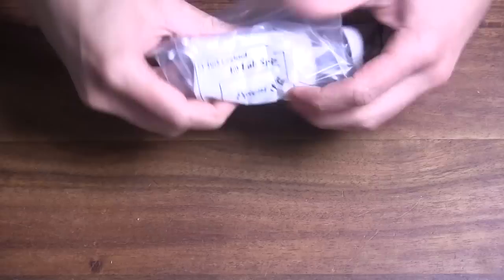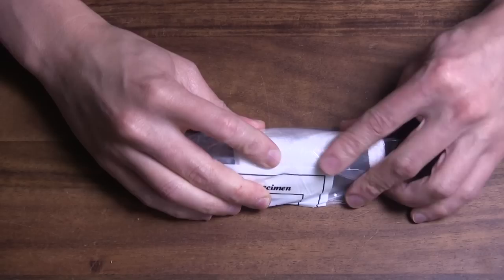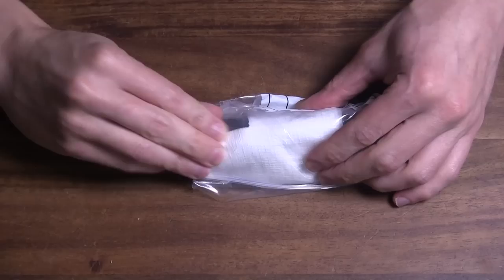And now you could tape this. I don't even find it necessary to tape. And now what you have is head here, patient's rest of the body here, and you have a very nice simulated cricothyroid.